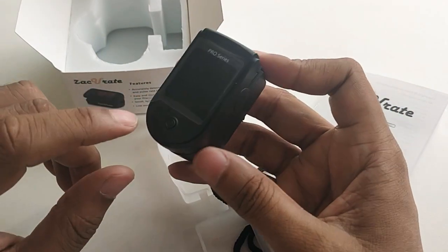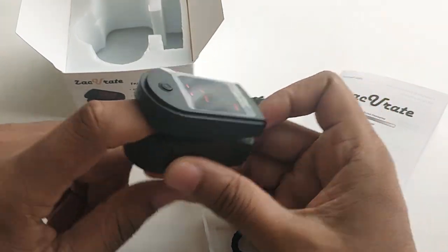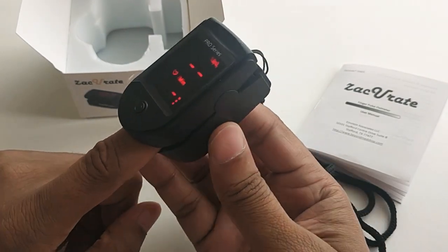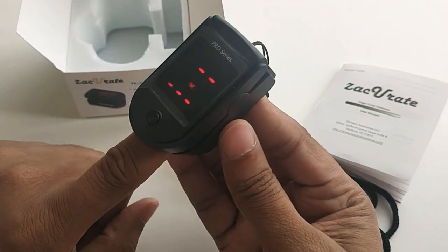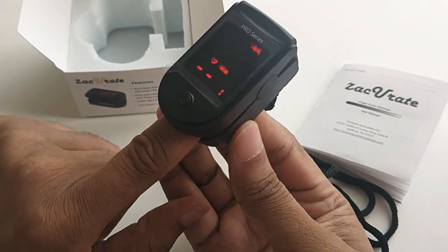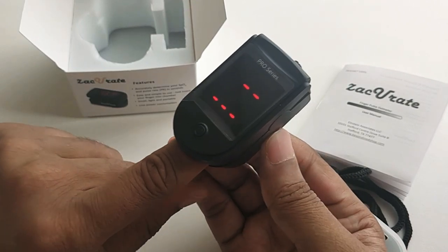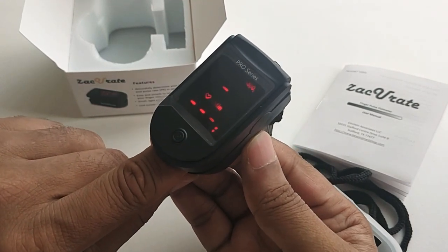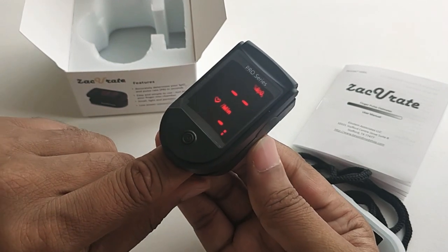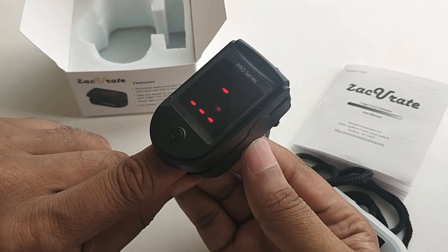Let's turn it on — just insert your finger deep into the panel and hold it for a few seconds. The upper reading, SpO2, shows the oxygen level.